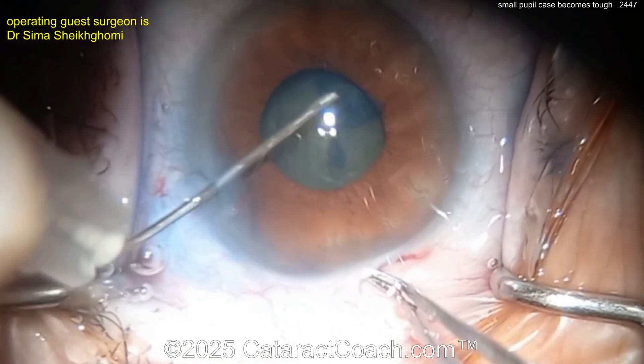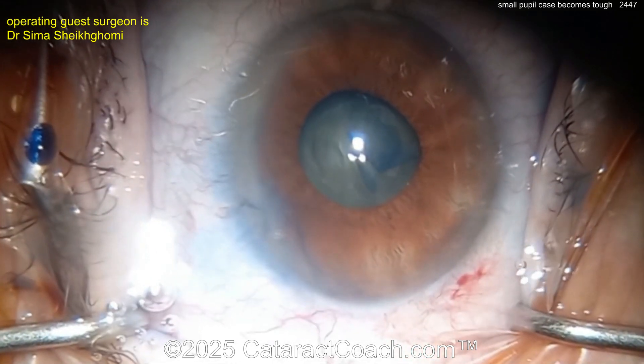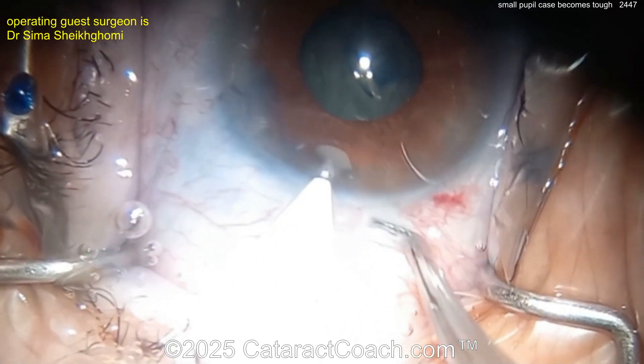Creating that rhexis, finishing it all with a sinskey hook alone — that's a great technique, good hands, very nicely done. But again, that's a baby rhexis, maybe three and a half millimeters.